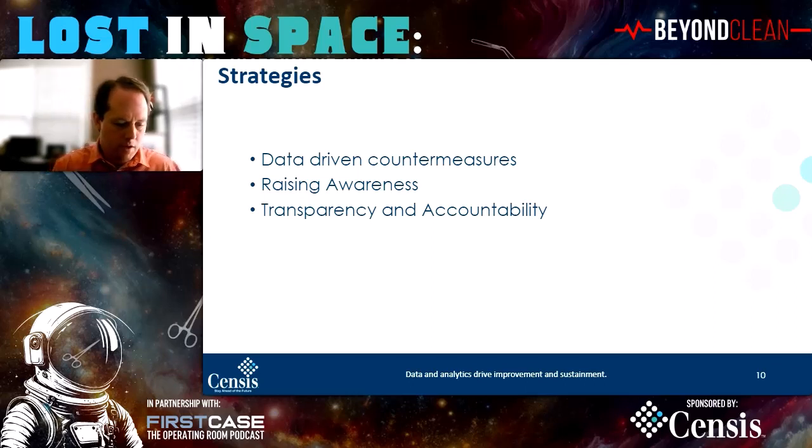So being able to say, okay, this is the kind of stuff that was missing last week, and then let's track that over the next month, 2 months, 6 months, and here's a target we want to get to. We think this is reasonable. You have to have the data in order to do that, right? So then 6 months later, you're not talking about just perceptions. Oh, we feel like a lot of clips and clamps are being thrown away.